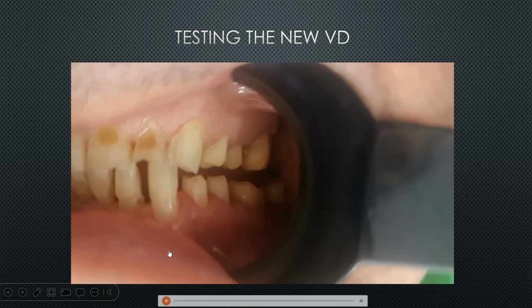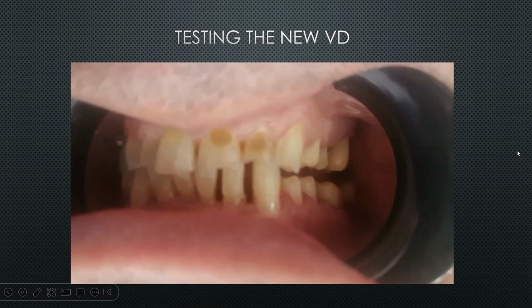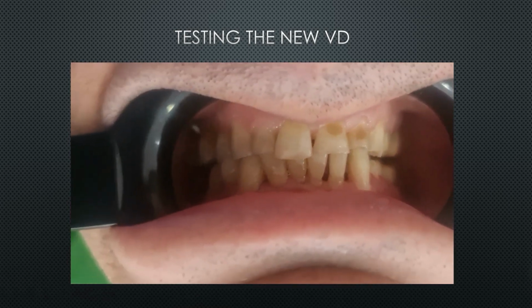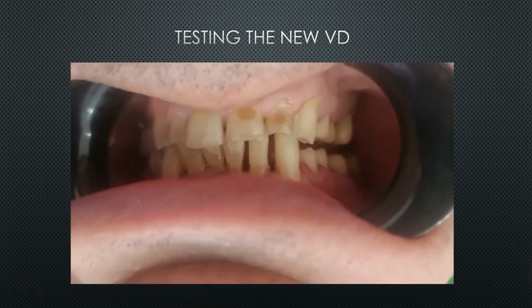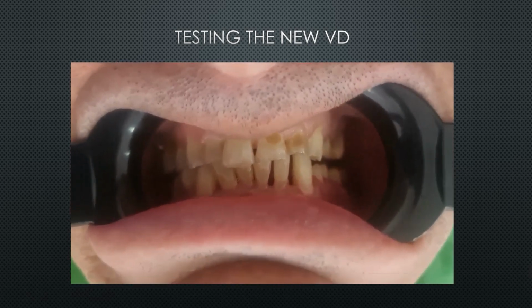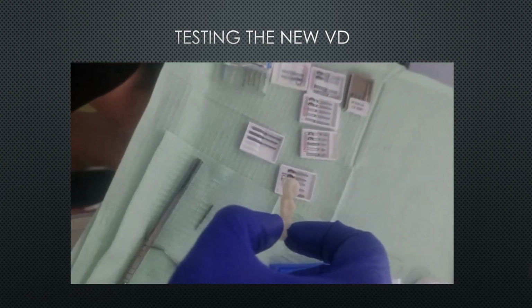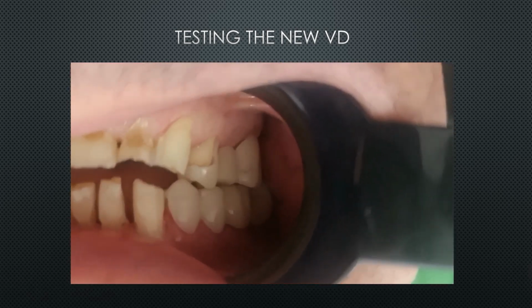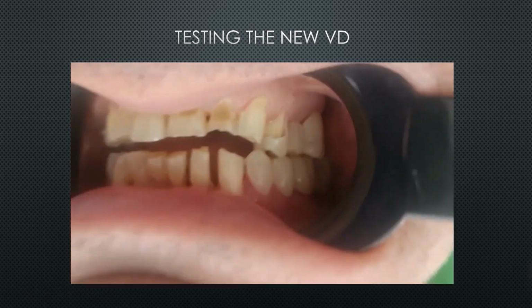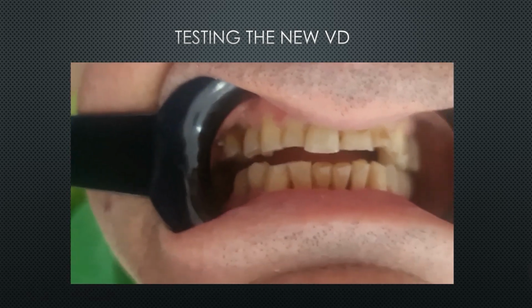Okay, so what we did here, what is this? This is some temporary teeth. I prefabricated it with the new vertical dimension so they can hold this vertical dimension during scanning. So I made a virtual preparation and I opened his bite by like 2.5 to 3 millimeter. I can't recall, I think it was 2.5 millimeters.